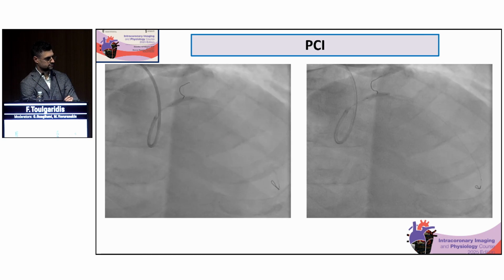Yeah, I think it's an interesting question you ask. When you ask, is it enough? The question is whether we can judge by angio at all. So one school of thought, and the one that I practically use, is to inflate an NC balloon sized exactly to the diameter that I will pick the stent with, from at least 2 projections, and if it's expanded, usually it means it's okay. However, if there was a nodule, it can come back. So I would tend to use imaging after plaque modification to see what I did in terms of modifying the calcium, whether I have fractures or not, whether I gain any lumen or not. This is what I would tend to do before I go with the stent.